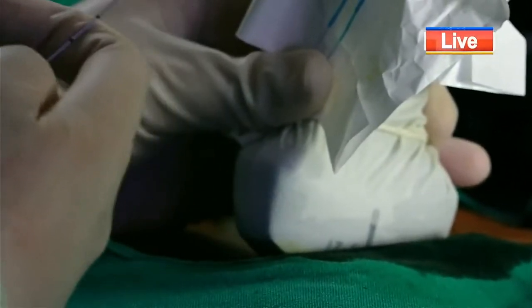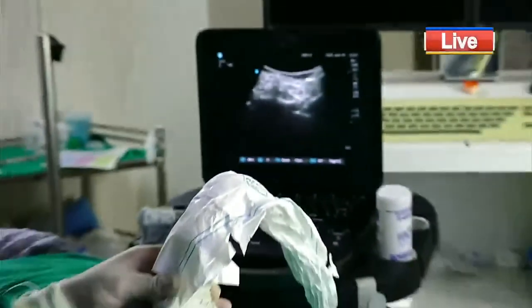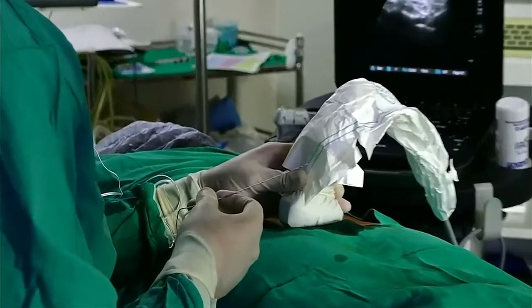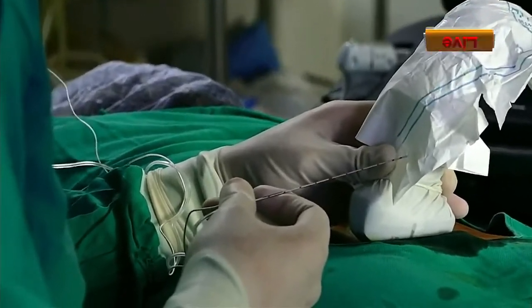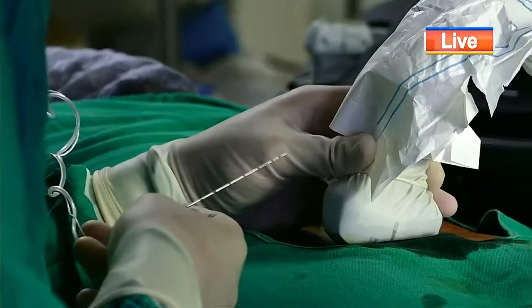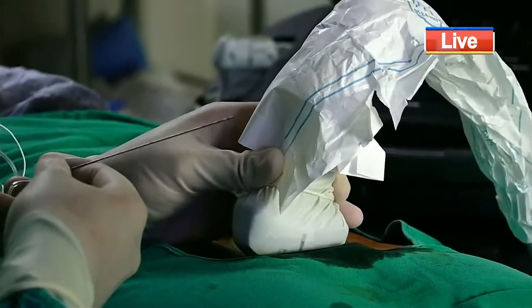Yeah, so we are using a needle which we usually use in regional anesthesia. It includes ideally the stimulation port also, and I am using the same one. This is an added advantage of being visualized under the sono guidance in 360 view rather than in 90 for our procedures.